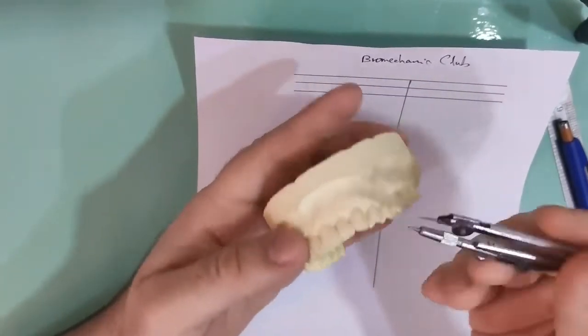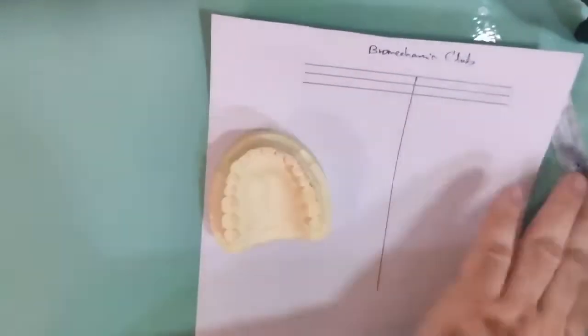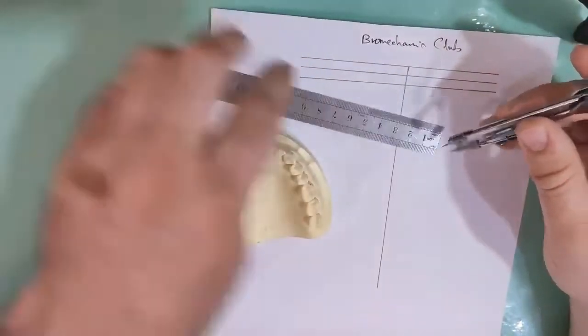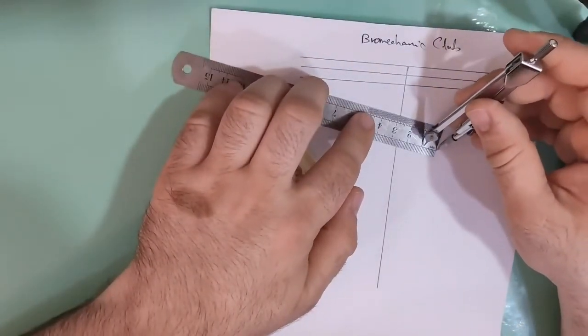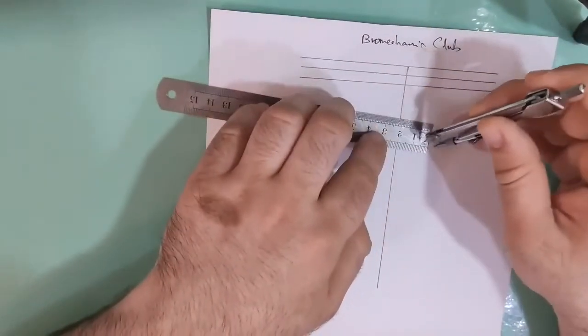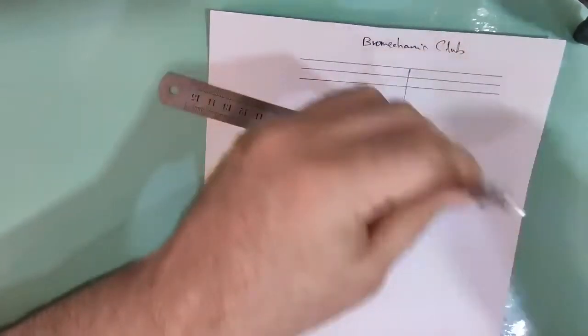I take the distal width of the first one, which is central, and I see what it looks like by millimeter. And I put it on one. For example, I put it on nine millimeter. So I put it on one and it becomes ten millimeter.